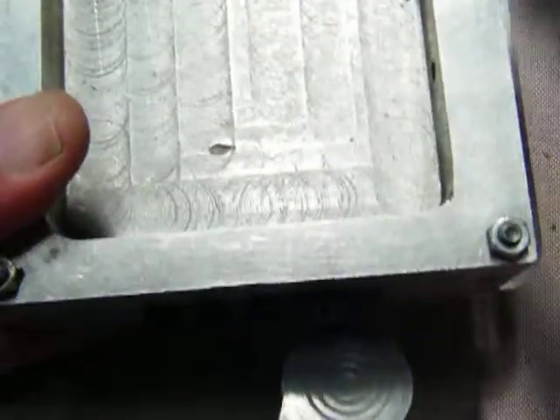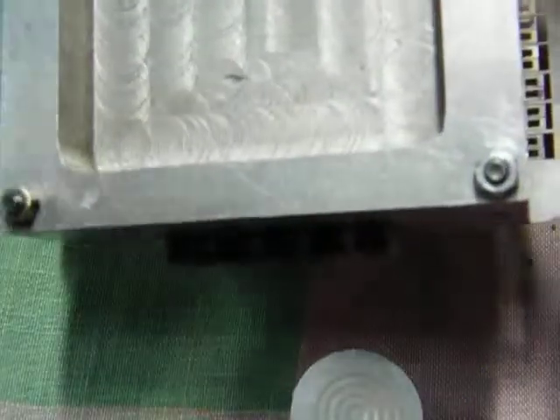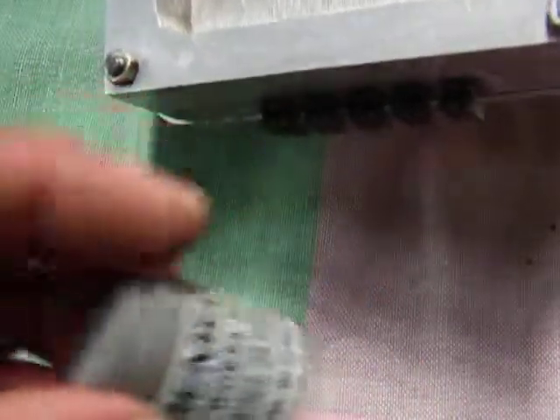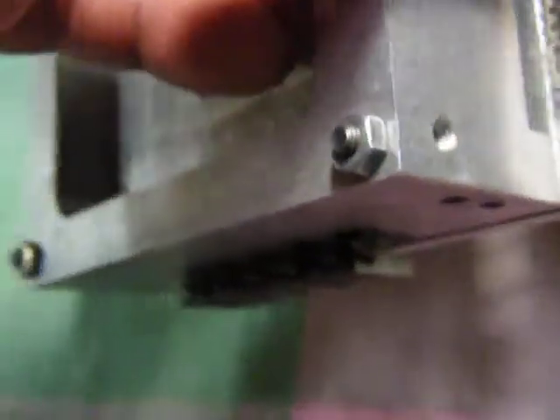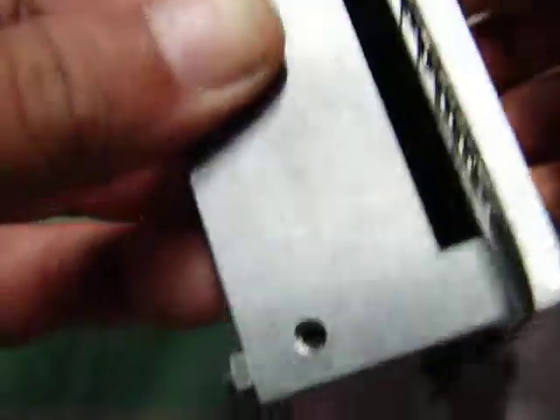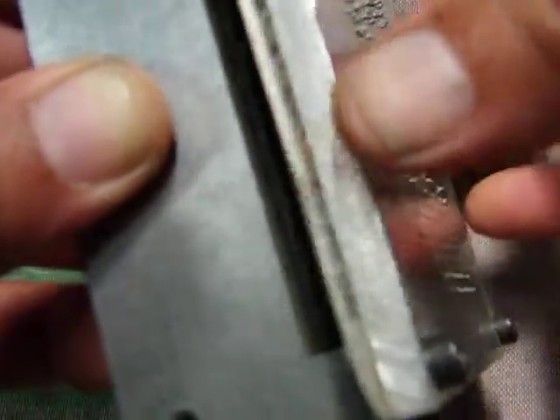And as you can see, I'm going to go back and zoom out as much as possible and slowly flip the device over to show you that there's absolutely nothing underneath. It's just a cavity over here. These are little boxes that are used to mount it at an oblique angle, so that I could show you what this cavity is meant for, some electronics that would go into the device. And as you can see, the slides are very thin. They are just half a millimeter thick over here.